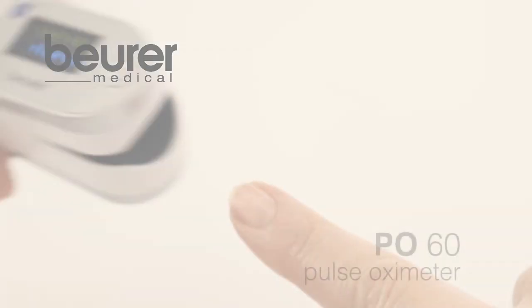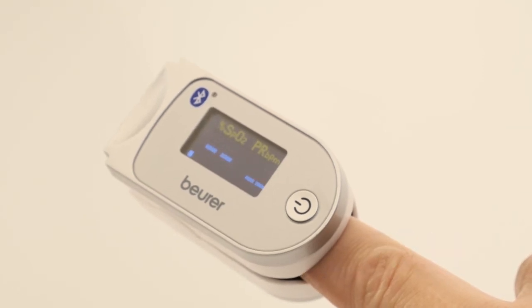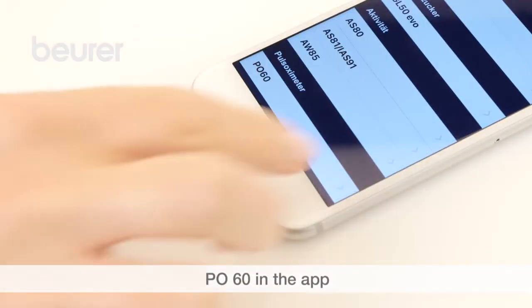Here are some tips for using your PO60 Pulse Oximeter from Beurer. Download the Beurer HealthManager app to enable full use of the PO60, then add the PO60 in the app settings.